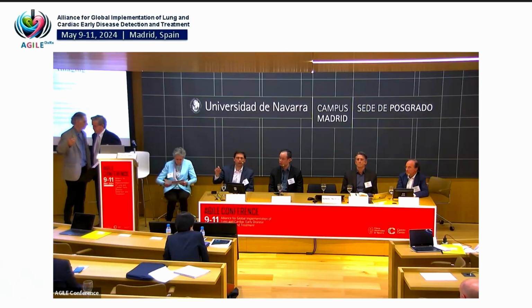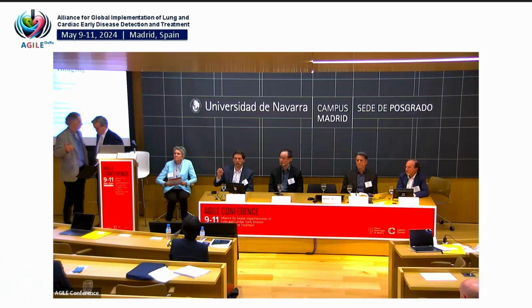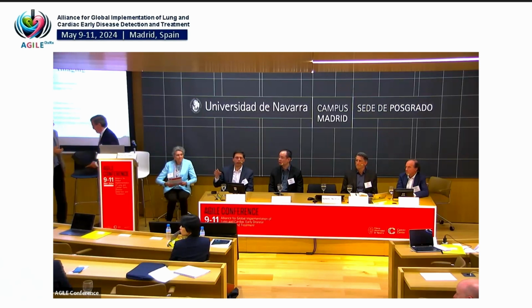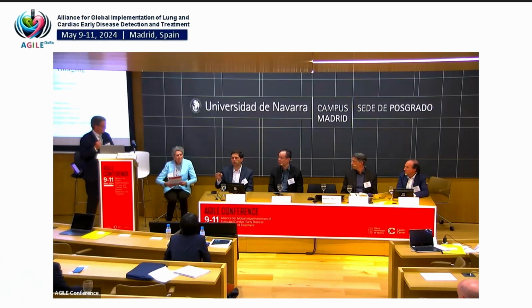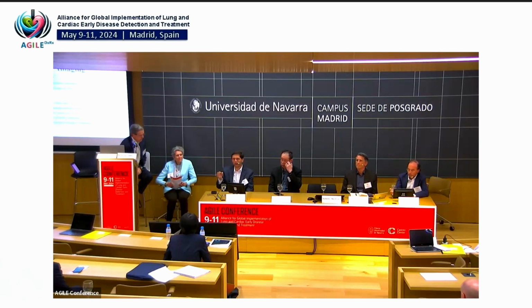One object is a real lung cancer detected in CT lung cancer screening. It's about 9 millimeters, I think, in diameter. The other object is a purely geometric object. It's a 6 by 3.6 by 3.6 millimeter ellipsoid. You'll see it often in the QIBA small lung nodule profile document. It also has what we call spiculations, and those look like cones sticking out of it. Those are about 8 millimeters.